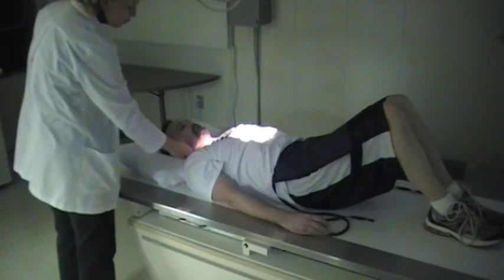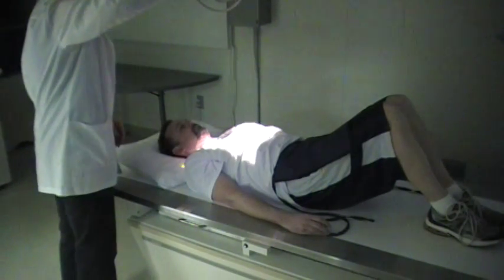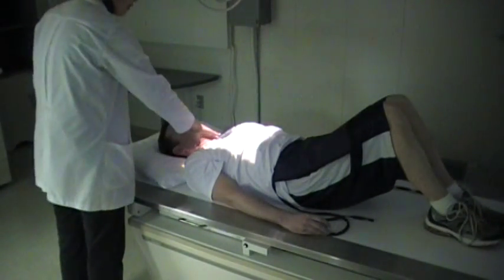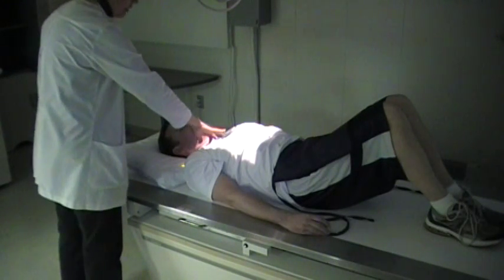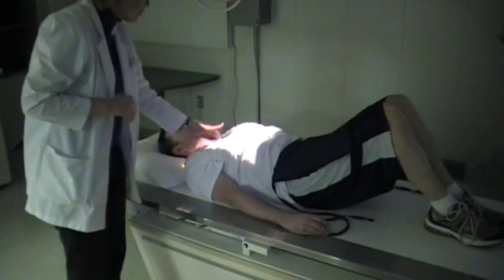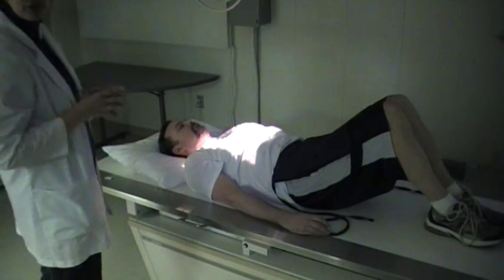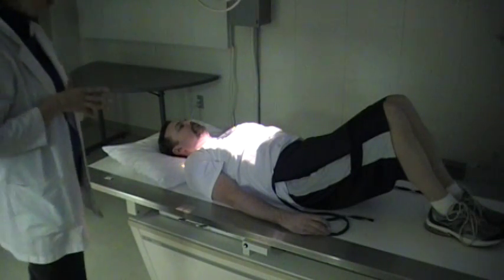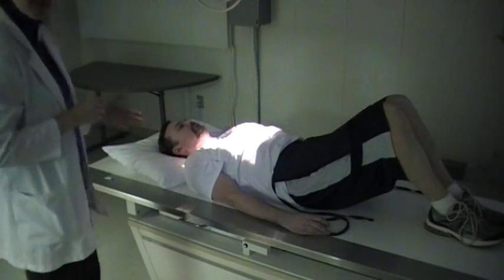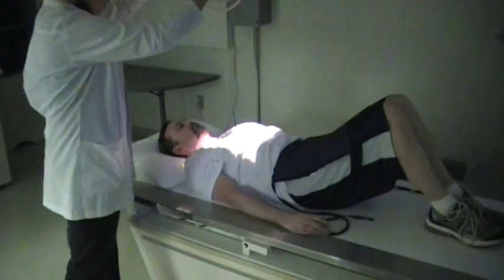You want to double check and make sure the top of your light field is going to coincide with an inch and a half above the relaxed shoulders. You can also check by palpating the jugular notch because you want the light field to be about two inches above the jugular notch. The jugular notch is at the level of T2, so make sure the light field is not at that level or you will be cutting off T1. Double check that the light field is about an inch and a half above the shoulders, then check the mid-sagittal line and collimate in.